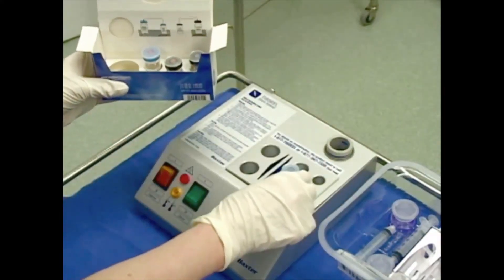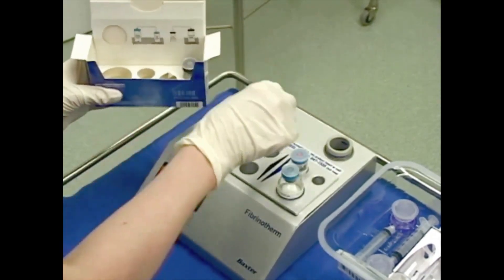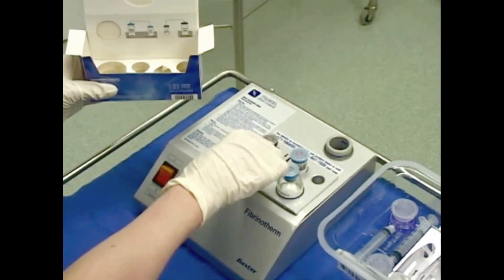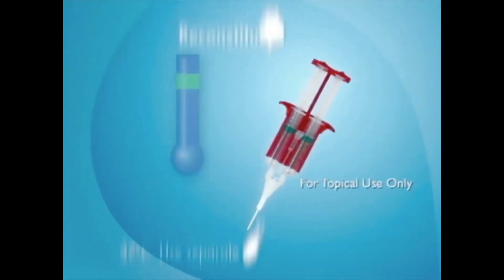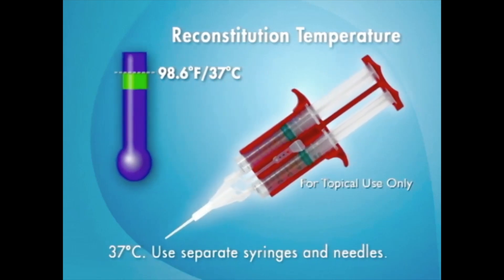Next, place all four vials into the pre-warmed, appropriately sized heating wells of the Fibrinotherm device and allow the vials to warm for up to five minutes. When the vials have been warmed to 37 degrees Celsius, begin reconstitution of the sealer protein solution.